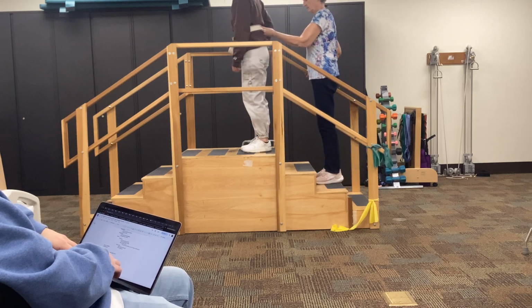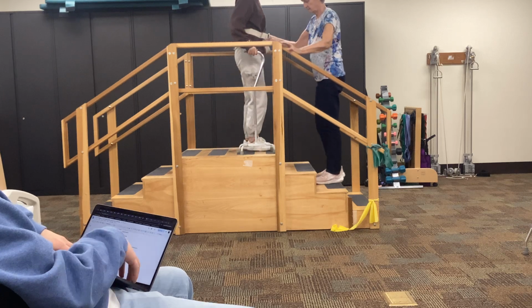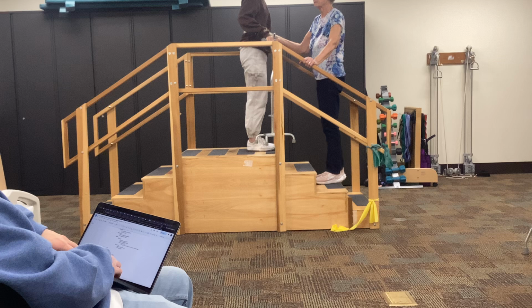Okay, go around. What you think? There you go.